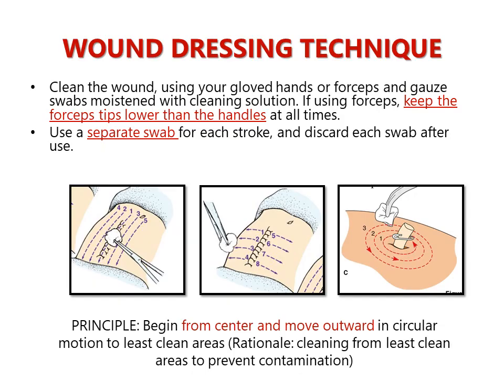Okay, this is an important procedure that all nurses should follow in doing the actual dressing technique. There are three photos on the slides right now. Normally when you perform the procedure, you will be using forceps, as I have discussed on the supplies and materials. In cleaning the wound, you will be using forceps. And in using the forceps, make sure that the lower tip of the forceps is facing towards the floor.